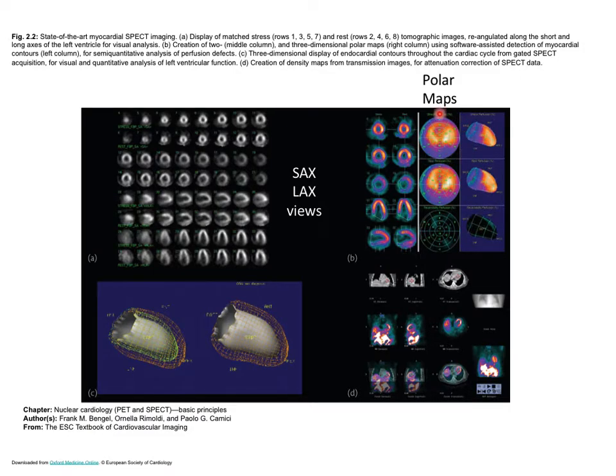And so this is a very convenient map because instantly you see the whole heart and you see if there's a dark spot, right? So you can make a call pretty quickly if this map is done accurately. And so it looks like for this heart, as we saw in the long axis views and in the short axis views, here's the posterior wall here. The posterior wall looks like it has no brightness there, no orange and white brightness, right? So there's a low perfusion down here.